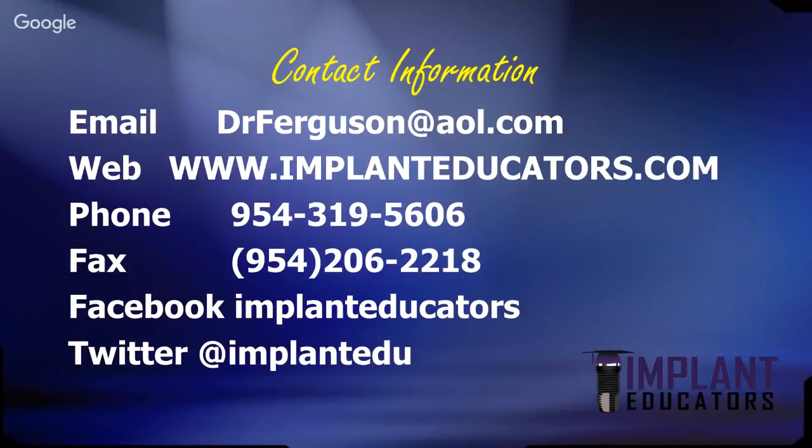And then the Ortho Clear, for example, and the LT Clear from Formlabs are for making orthodontic appliances and night guards. So those are going to be a little bit more expensive. Those appliances are probably going to run you again in the $3 to $5 range because you're buying the more expensive resins for that. But you have to use those, especially the Ortho Clear material, for long-term intraoral use.